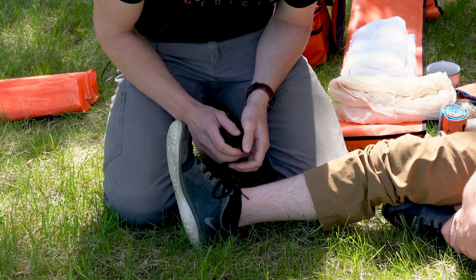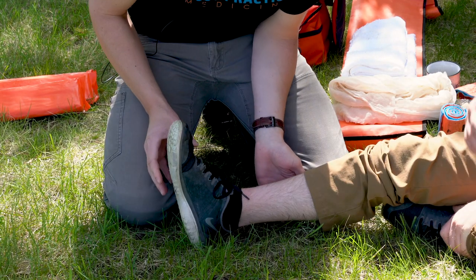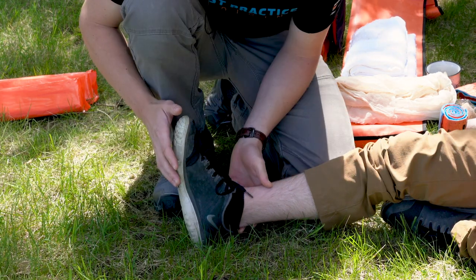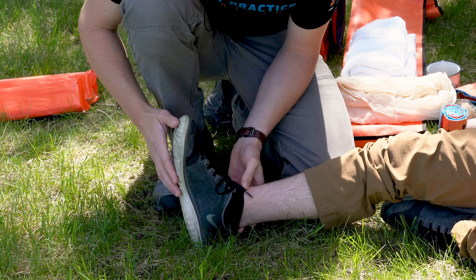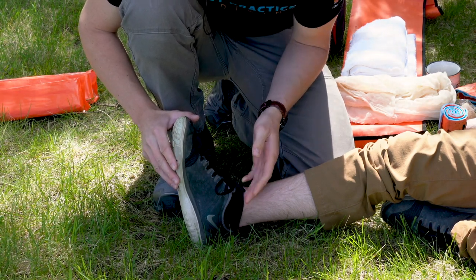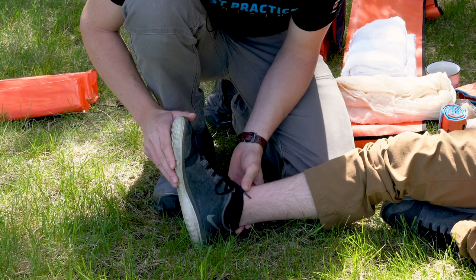When manually stabilizing and immobilizing an injury, remember to stabilize above and below the injured part. Ideally, a position of function in the foot will be maintained, which is this neutral anatomic position. However, for an injury to the joint, we're not permitted to attempt realignment.